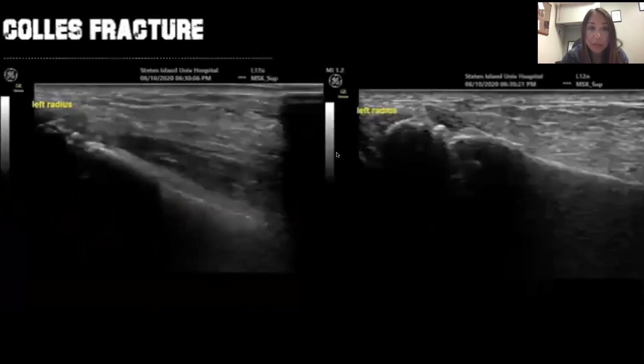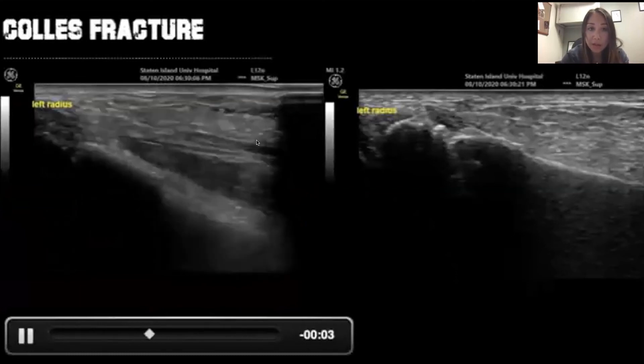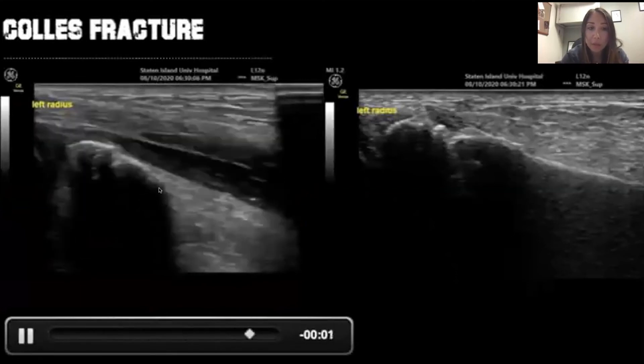When we completed our reduction, we did a post-reduction ultrasound, and you can see everything is beautifully aligned.